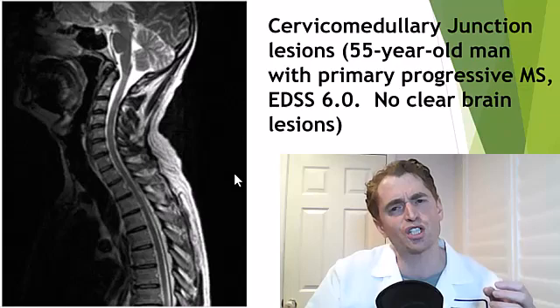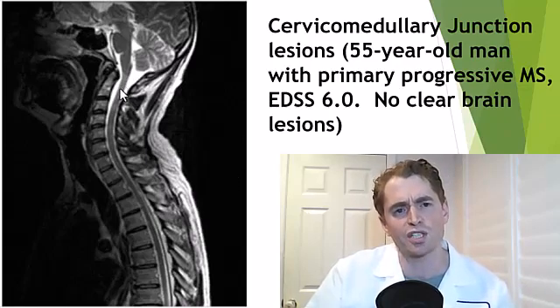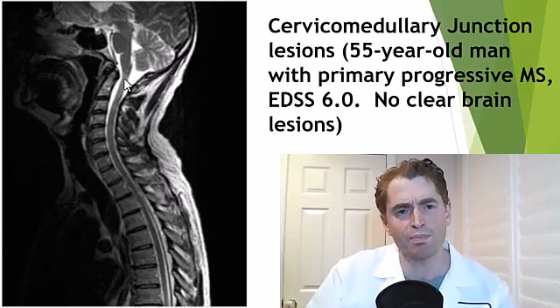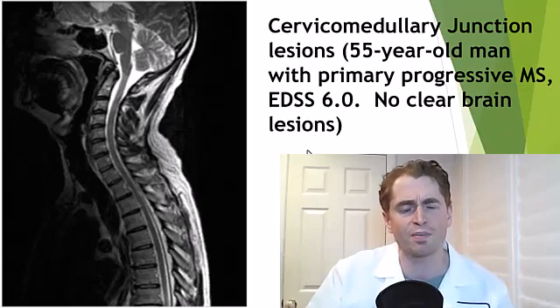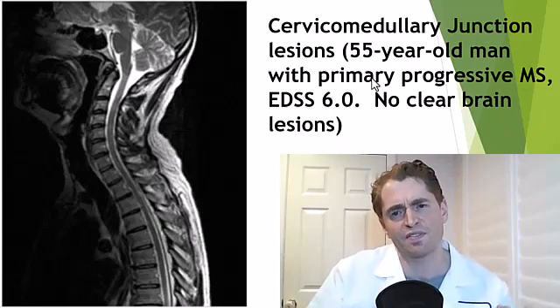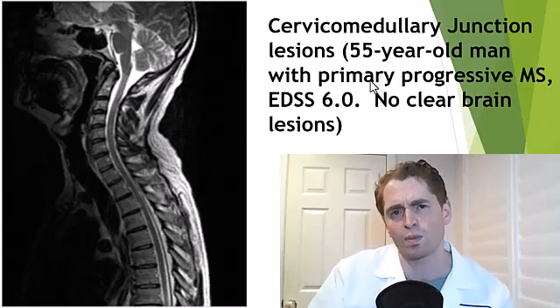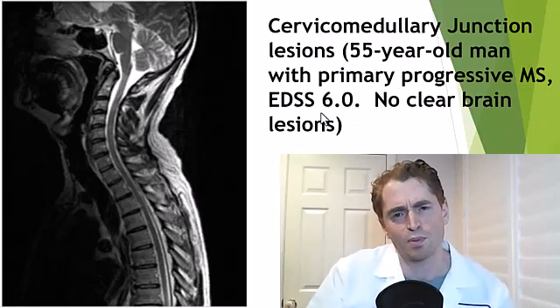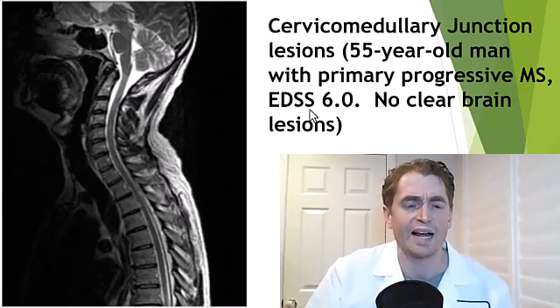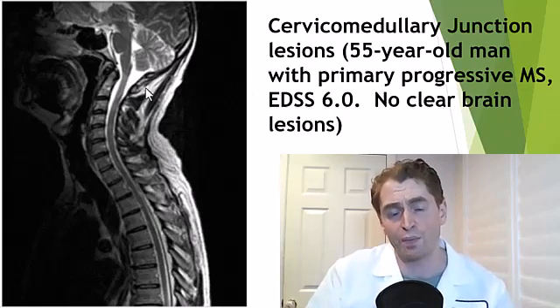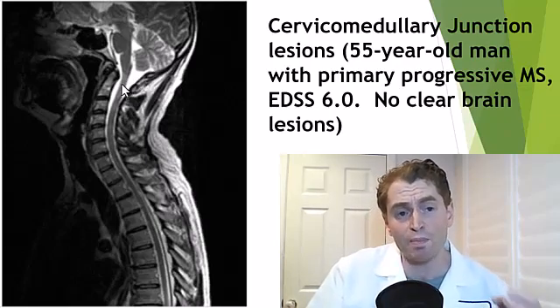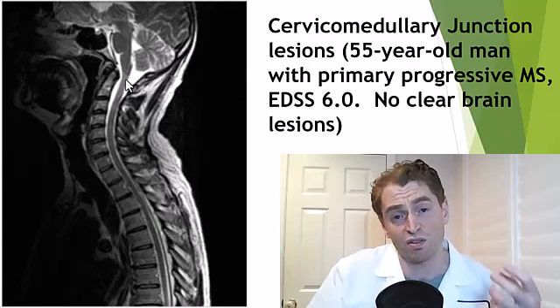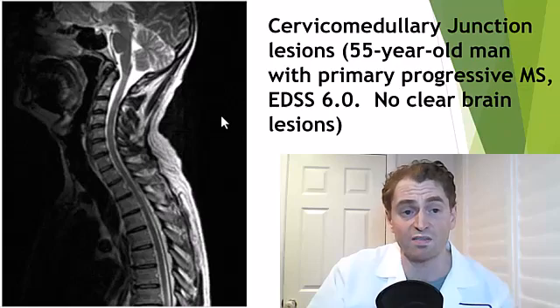Next is an example of a cervical medullary lesion — a lesion that bridges the upper cervical spine into the medulla, the bottom of the brain stem. This is an example from a unique situation: a 55-year-old man who actually has no other lesions in the spine or brain, which is very atypical of multiple sclerosis. He has a primary progressive phenotype and an EDSS score of six, meaning he needs a cane to walk 100 meters. This is quite rare. Usually these lesions are associated with typical MS plaques, but in general, cervical medullary junction lesions are associated with progressive weakness of the limbs and often a progressive course of MS.